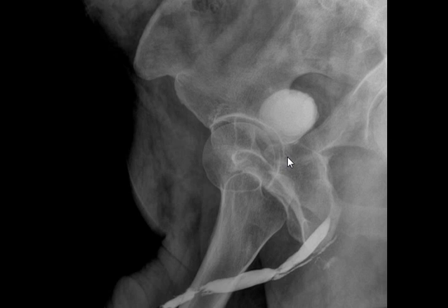Especially if you have a fluoroscopy unit, you go under direct vision, real-time video, to see it. How to do it, okay. You stop when there is intolerable pain first, or if you see the contrast passing to the bladder, then you have visualized the entire urethra. Or if you have a lot of resistance, you push and you feel resistance, you stop, because if you push harder you might rupture the urethra, which you don't want to do.